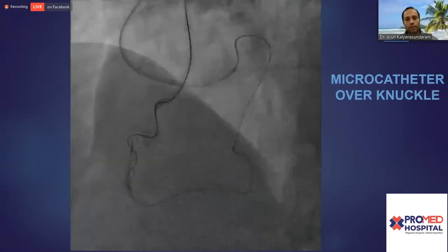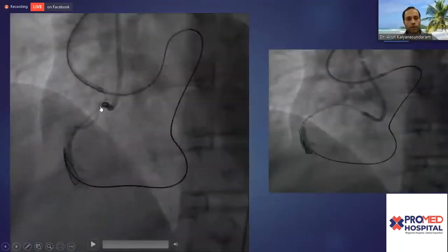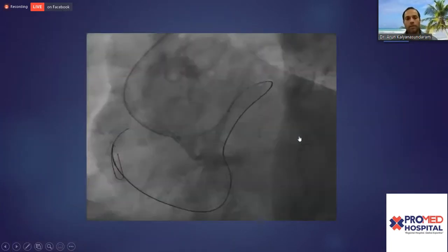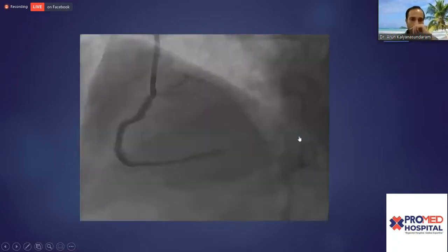Microcatheter over the knuckled wire, antegrade. And essentially at this point, you can see the guide extension catheter has kind of straightened out the vessel. And here, guide extension catheter balloon, it's a GuideLiner or a Guidezilla guide extension reverse CART, essentially. Retrograde wire into the antegrade guide extension catheter. That's the final result.